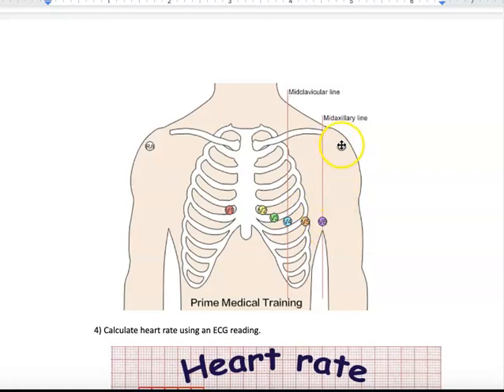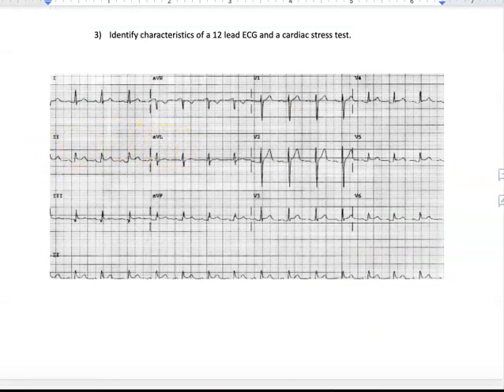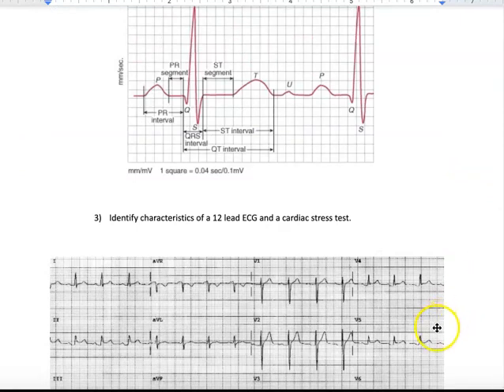But you also have windows, and you got to trust me on this, coming down from this electrode to this electrode, down this way. So again, trust me on this, with 10 electrodes, you get 12 different views of the heart. And so the EKG, the one I showed you up here, is usually the way it looks in V5. But the EKG, the way the electricity is conducting, is going to look different depending on what window you are looking through.